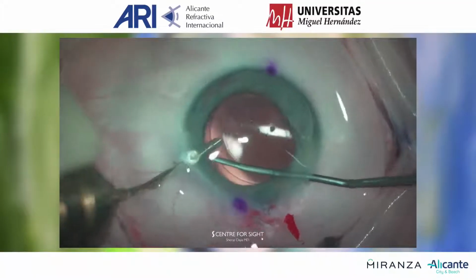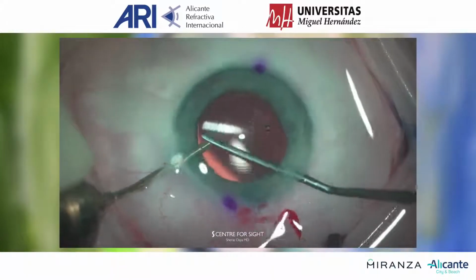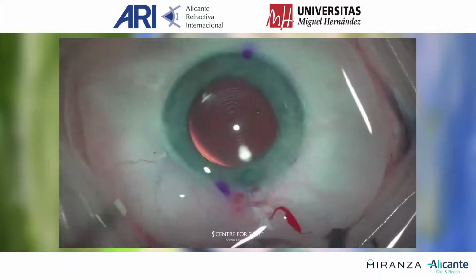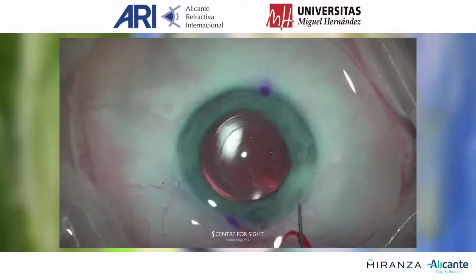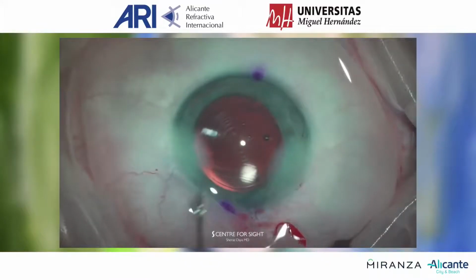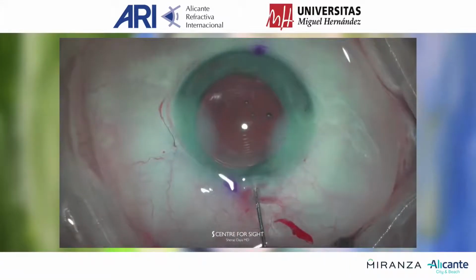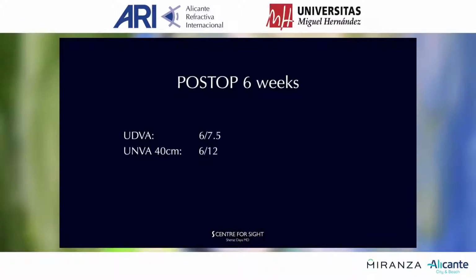It's a pity that the haptics are not stained another color to make them more visible. You can see that was quite hard to see, but it was above the iris. Anyway, that lens is now well centered, and that looks very satisfactory. The wounds are sealed, irrigation aspiration has already taken place here, and I'm seeing the superior incision as well. Post-op she was very pleased with a distance acuity of 6/7.5 and a near acuity of 6/12.